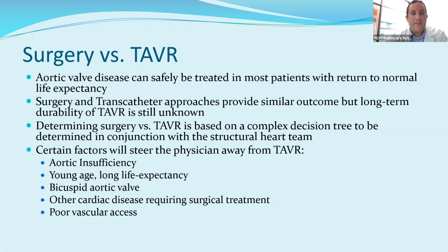And certain factors may steer the physician away from a transcatheter valve. That includes aortic insufficiency, young age, long life expectancy, bicuspid aortic valve disease, other cardiac disease requiring surgical treatment, and poor vascular access.